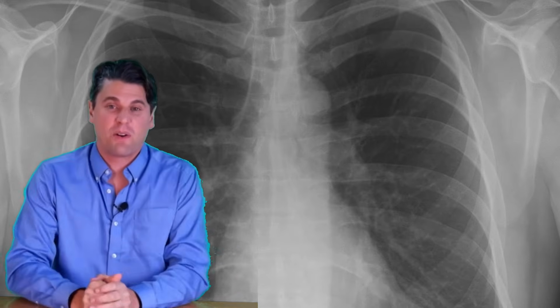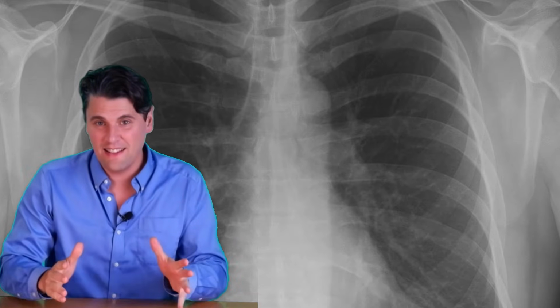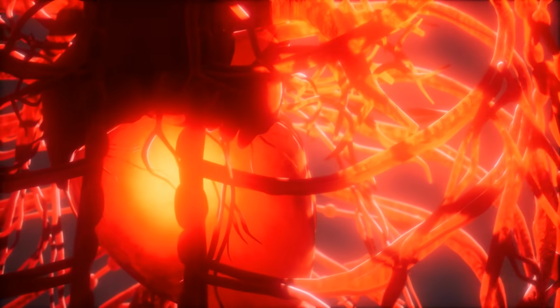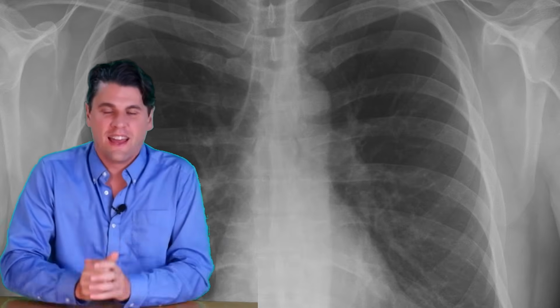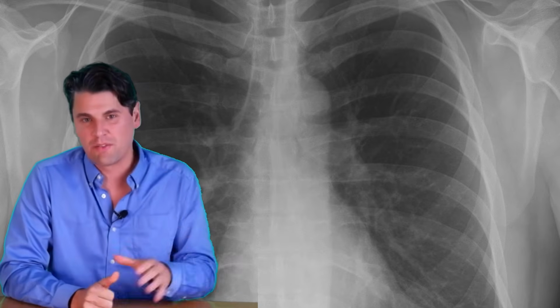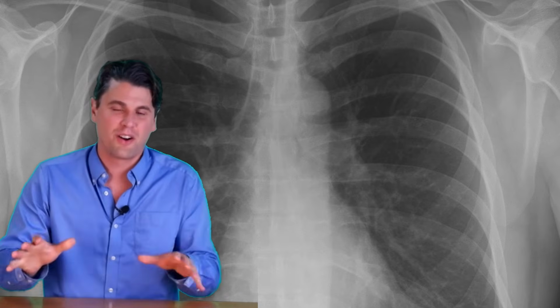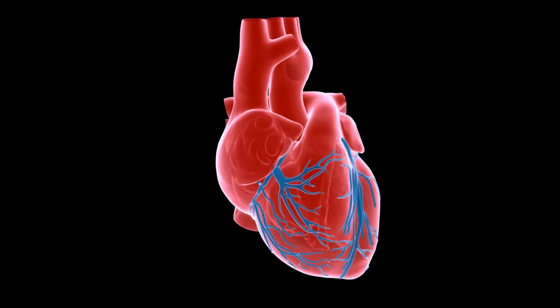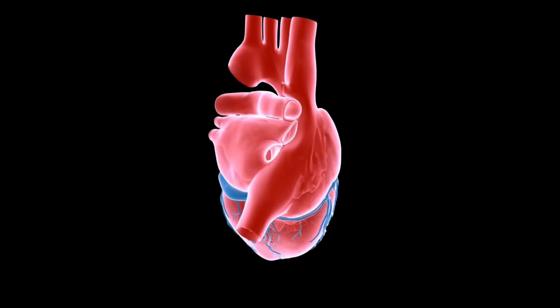All right, Red Nation. Today we're going to be talking about cardiac CT. This is an area that's been really hot in CT imaging for the last 20 years and is an area where the vendors really try and show off as far as the technology such that they can image the beating heart. As you can imagine, imaging the beating heart is going to be one of the most difficult challenges from a temporal resolution perspective on the system.